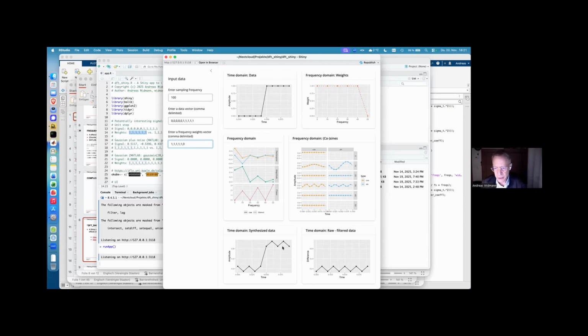One approach I frequently recommend when people ask me how to recognize filter distortions or filter artifacts is to look at the difference between the raw and the filtered data, to just see what we have filtered away. Because if there is any structure in what we have filtered away, something which is not noise, then we have removed parts of our signal, because we only want to remove noise components. In the example before, we had only noise here, so we could perfectly recover our signal. But if there's structure, you have band limited your signal.